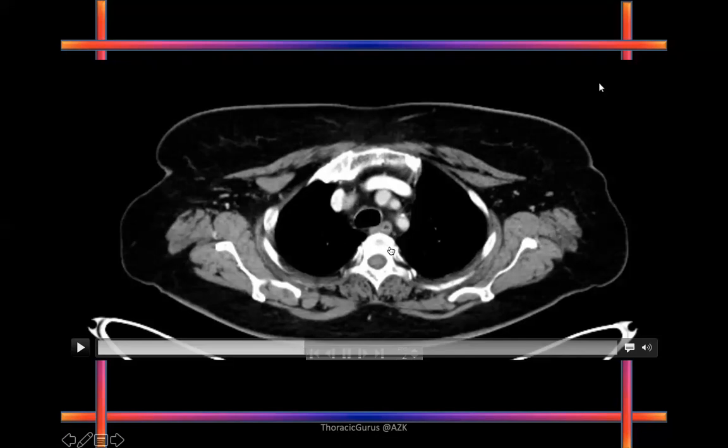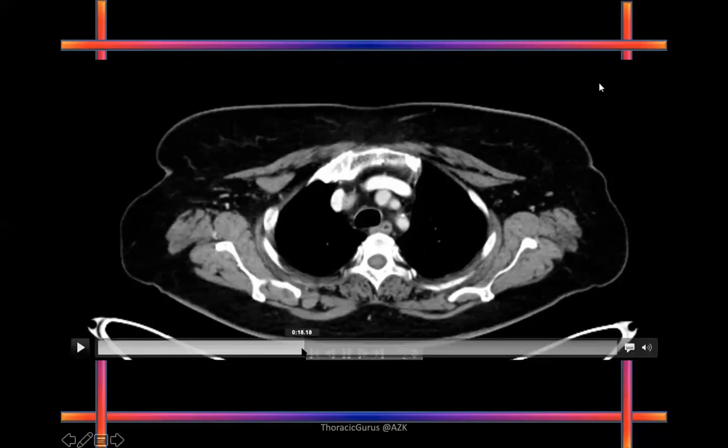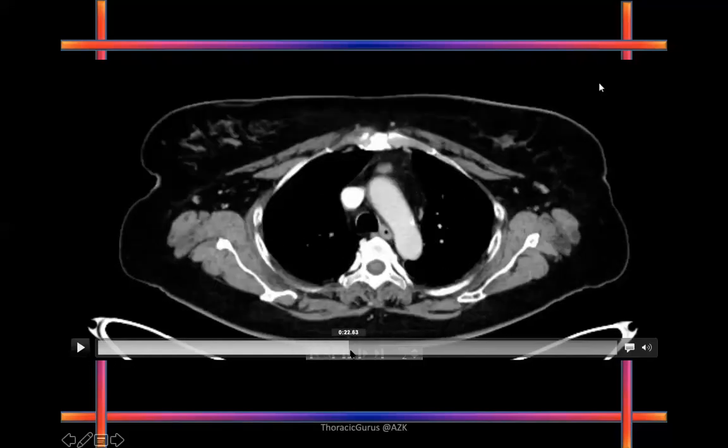Why do you think it's esophagus? What are the features that are telling you that this is esophagus? It's behind the trachea and it is in front of the spine. Location is important? Yes. And it looks like a muscular tube with an opening inside. Excellent. And with what inside? There is air inside. That's right. So that's why it's called the esophagus. Easy? Anything difficult about this so far? No. Okay. Now, the next CT.